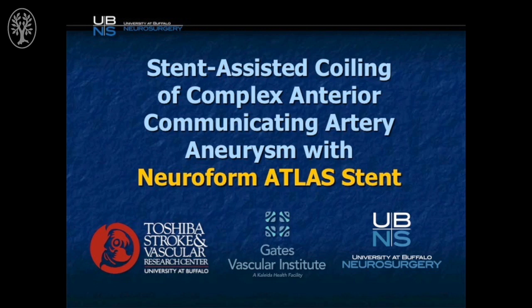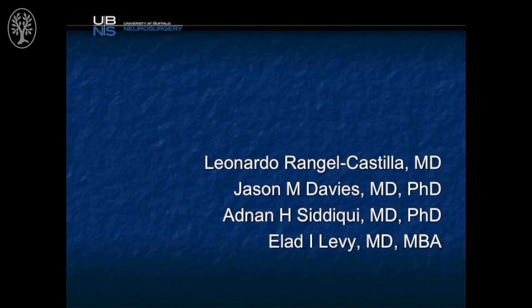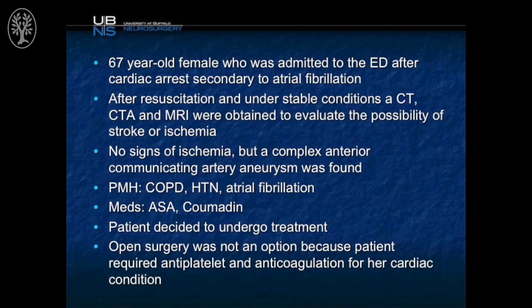This case is of a stent-assisted coiling of a complex anterior communicating artery aneurysm using the Neuroform Atlas stent. Here we explore a 67-year-old female who was admitted to the emergency room after cardiac arrest secondary to atrial fibrillation.